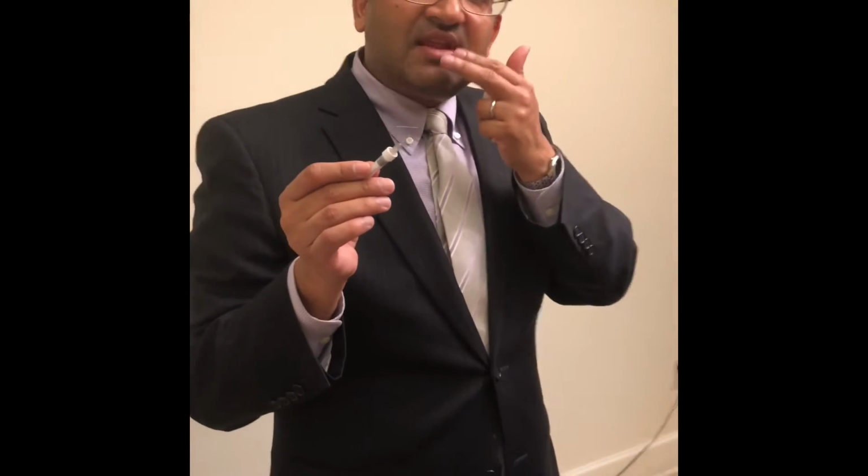And as a matter of fact, I love this cannula so much. Most of my filling, whether it's the cheeks, temples, and sometimes even the lips and lower face and jaw region, are all done with the cannula. Typically, my rate for bruising is maybe 1 to 2% compared to when I was using a needle, and it could be as high as 10 to 15%.